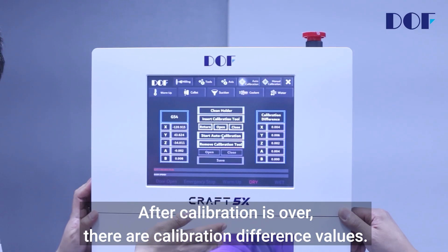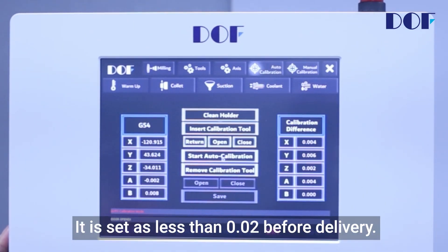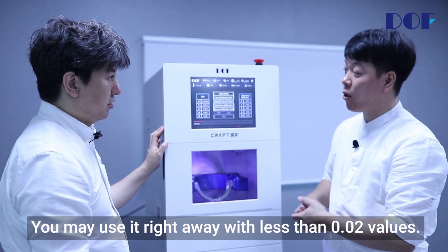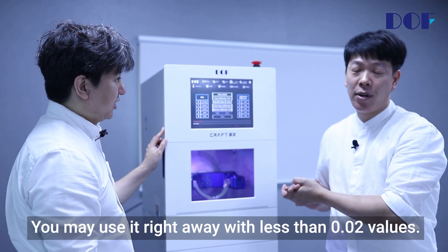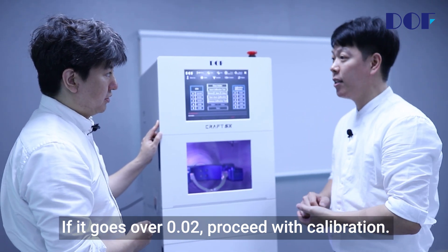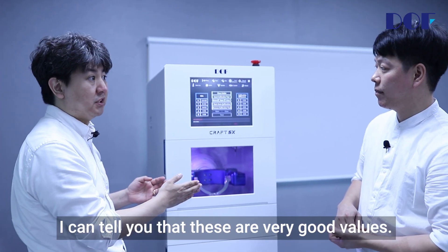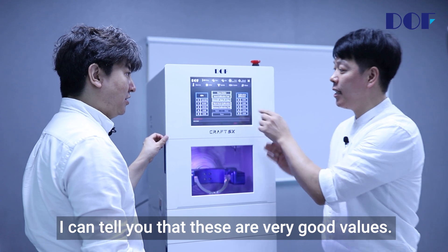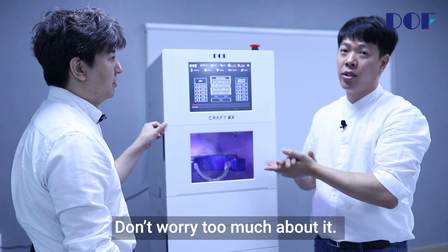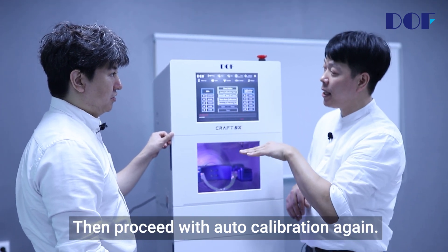After calibration is over, there are calibration difference values. The calibration tolerance is set to less than 0.02 before delivery. You may use the machine right away with values less than 0.02. If it goes over 0.02, proceed with calibration again. The values are around 0.002 to 0.004 — these are very good values. However, the z-axis may be 0.05 in winter; don't worry too much about it. Proceed with auto calibration again if needed.